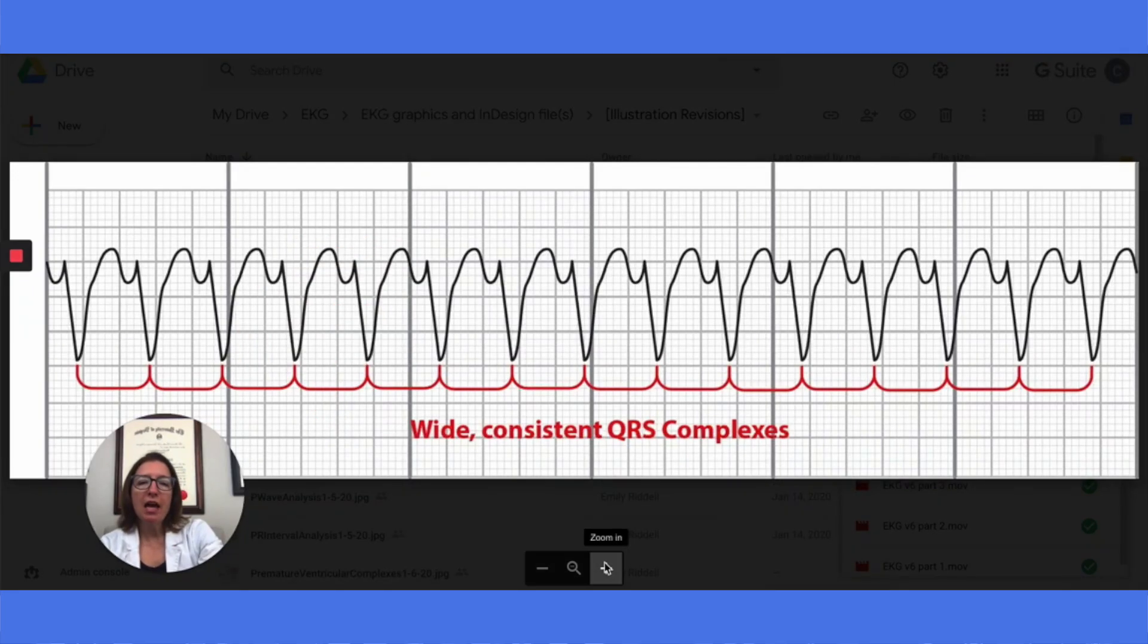In this strip, we have ventricular tachycardia. You can see we have these wide QRS complexes. They're definitely over three small boxes wide. We don't have any P waves. These QRS complexes are wide, but they are regular. So our ventricular heart rhythm is regular.